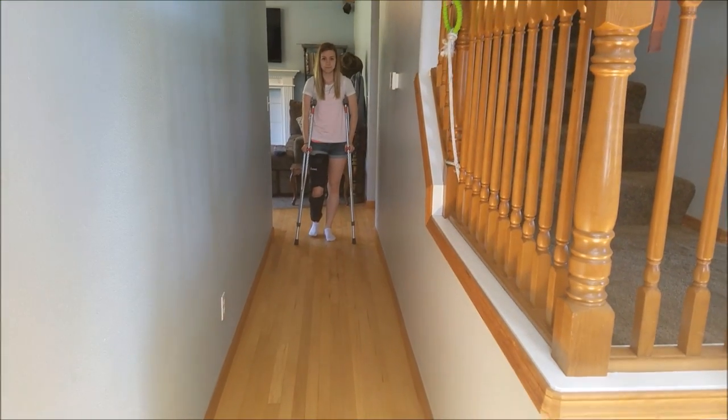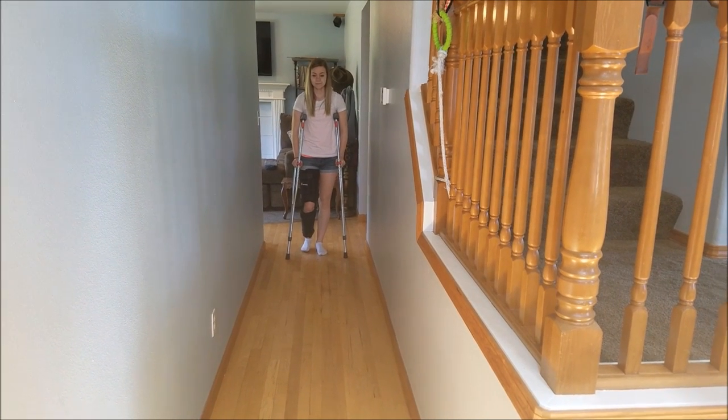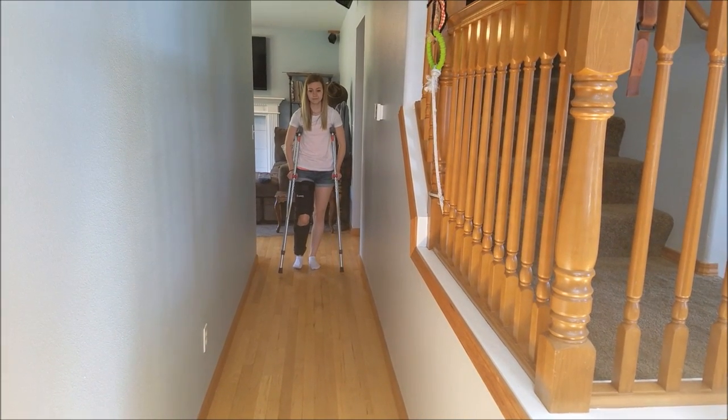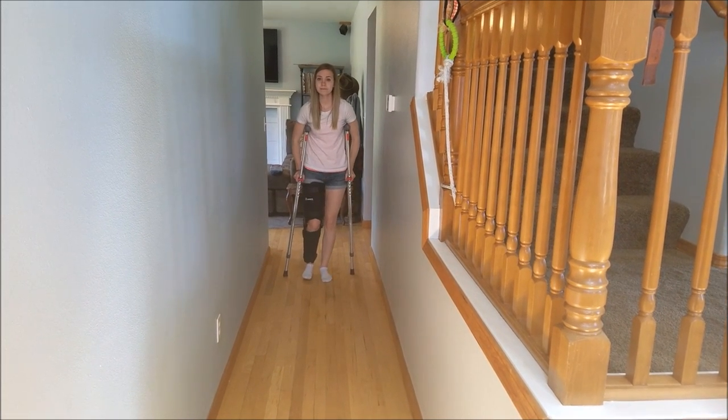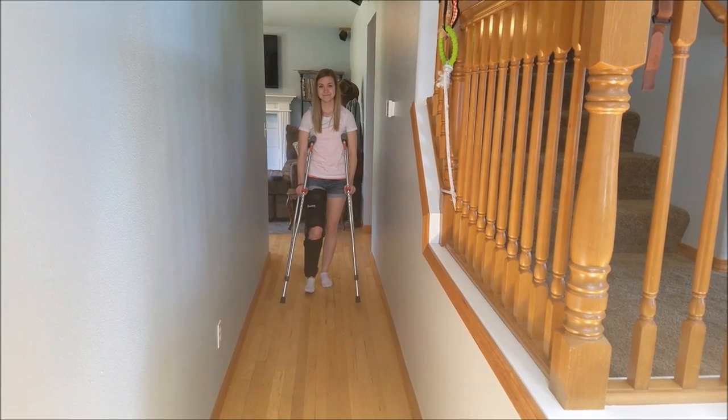The three point gait for non-weight bearing. Advance both crutches and the injured leg. Advance the good leg. Always look forward and not at your feet.